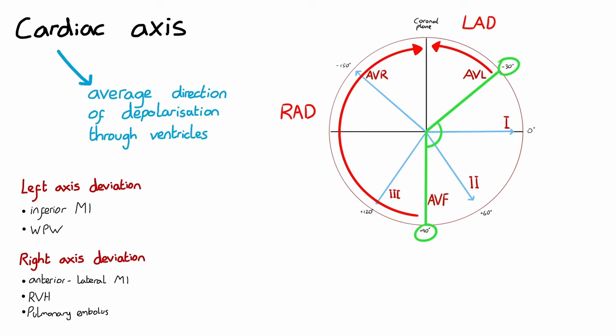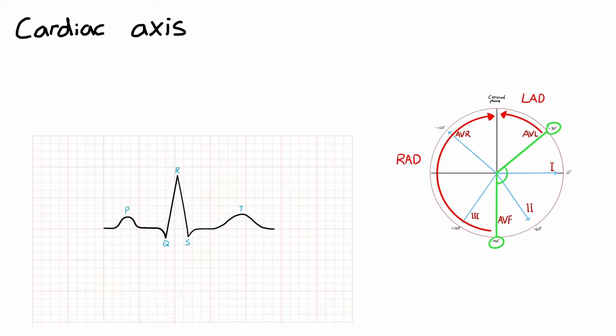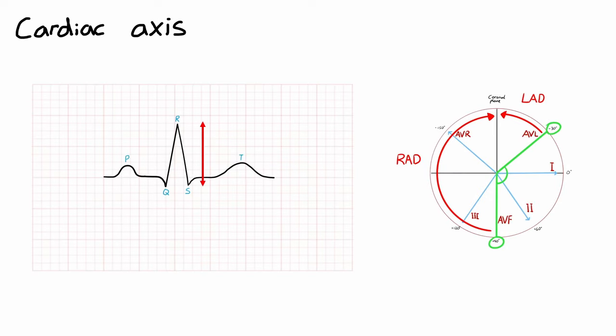Now you will not be expected to calculate the cardiac axis for medical school exams; however, you should be able to identify if there's left axis deviation or right axis deviation. To do this we're going to use the QRS complexes in three different leads. The more positive a QRS complex is in a particular lead—that is, the larger the amplitude of the R wave—the more in line with this lead direction the cardiac axis is likely to lie.